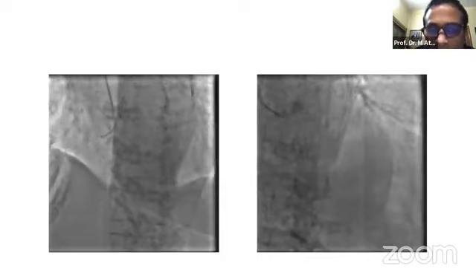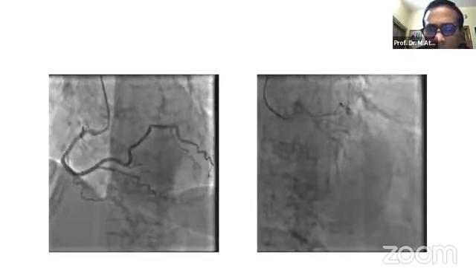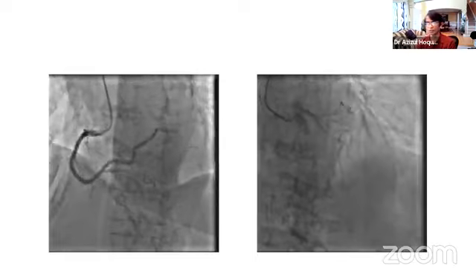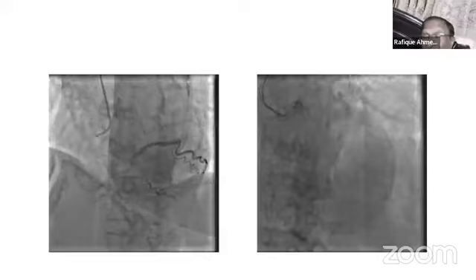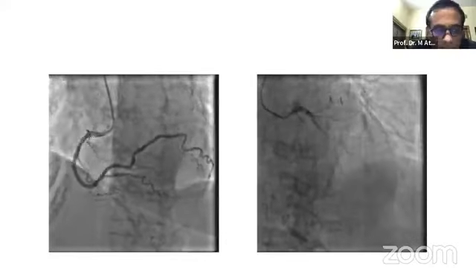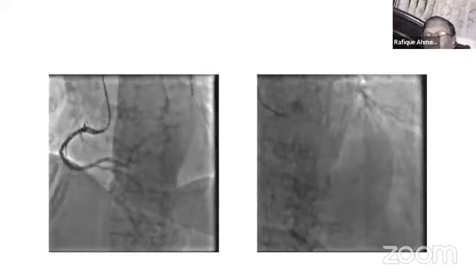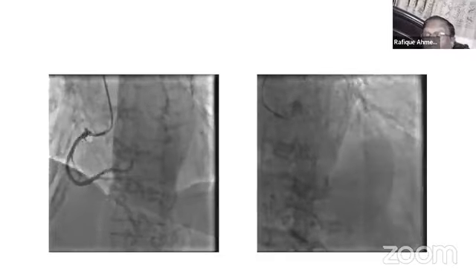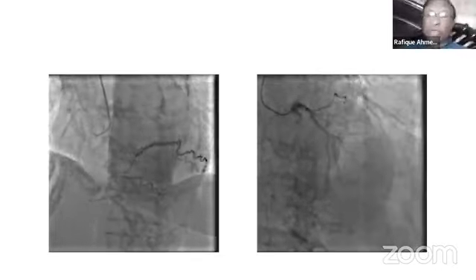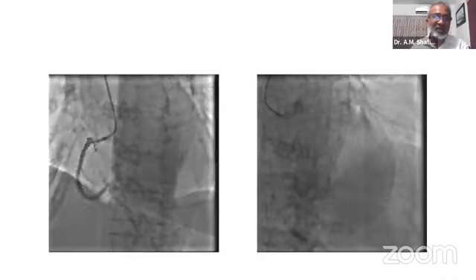Robi sir, I have a question, sir. Can it be memory effect, sir, after the termination? Yeah, but it's after 1 week. The memory effect happens when you pace the ventricle. If somebody was in ventricular tachycardia and you convert, you can see T inversion, or somebody who has been pacing. That is difficult to explain by just the memory effect, and it is such an extensive T inversion. As I told you, it looks like the EKG that we see in massive CVA, with QT prolongation. Right, sir. But I could not get the explanation. That is why I have given it here.